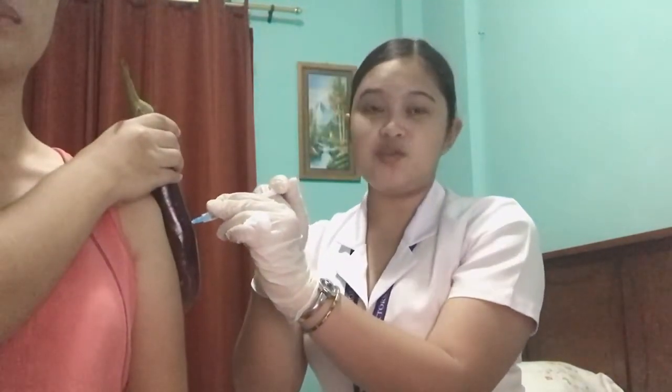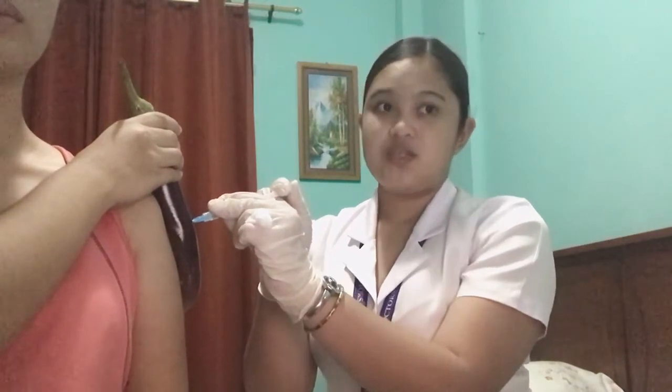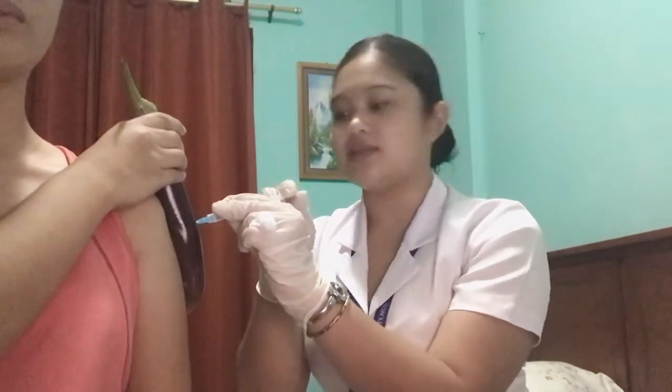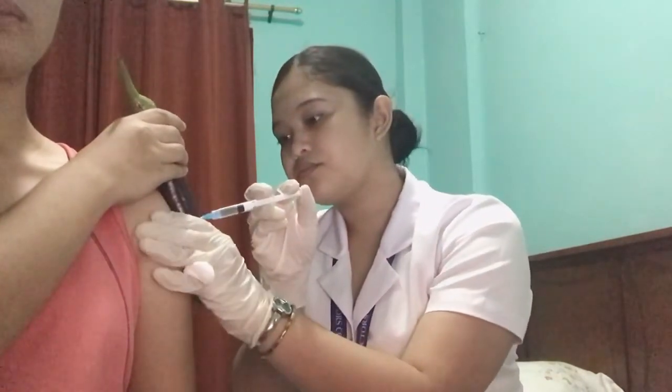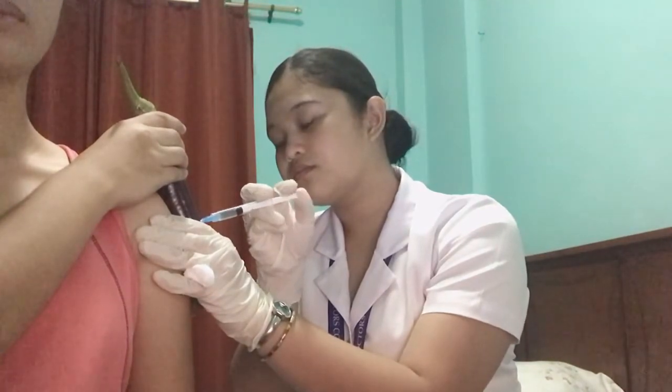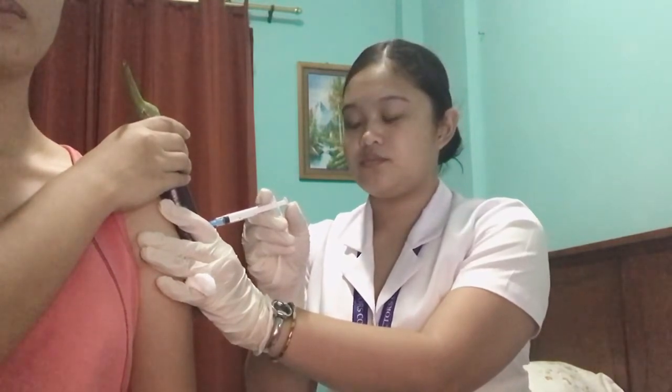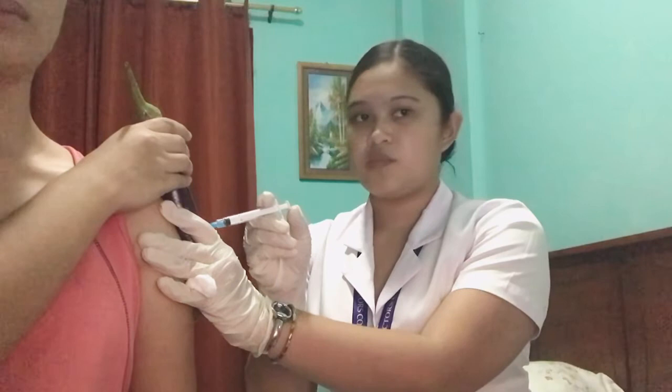If blood appears, use another side and discard the syringe. If no blood appears, then proceed. Then inject the medication at 1 ml per 20 seconds. Then wait for 20 seconds and slowly withdraw the needle. Then release the skin and place the cotton. Apply it gently, but do not massage the area. Then document the procedure.